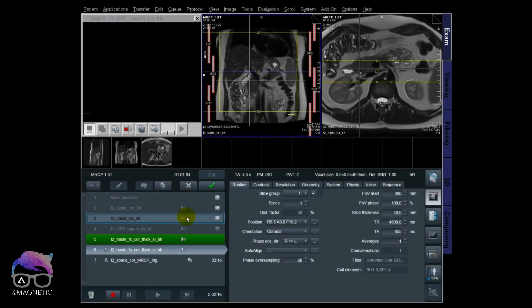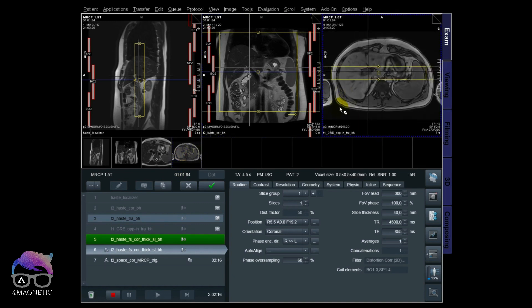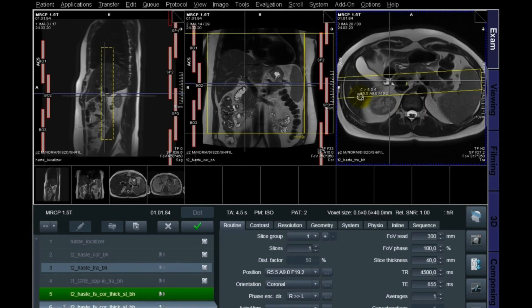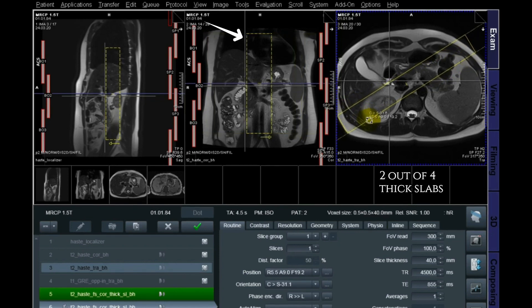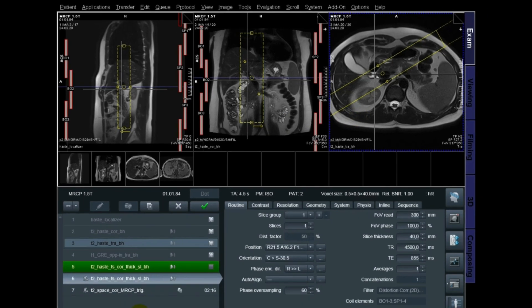I do a breath hold on that one. The next step is the T1-weighted sequence — just checking image quality, looks fine, covering from top to bottom. Then for the thick slab I want to do an oblique coronal, so I angle it until it's more than 45 degrees and position it along the common bile duct while waiting for the first coronal thick slab.